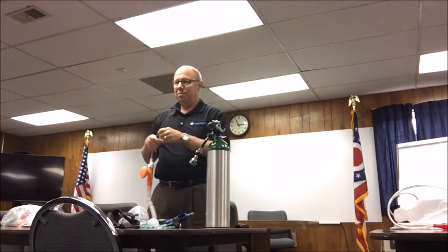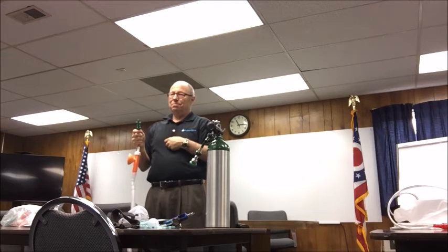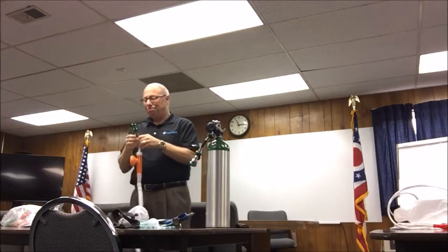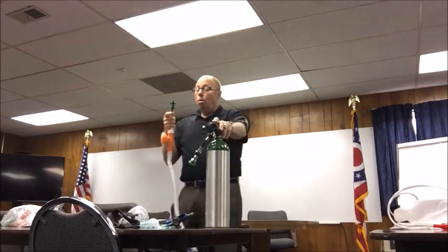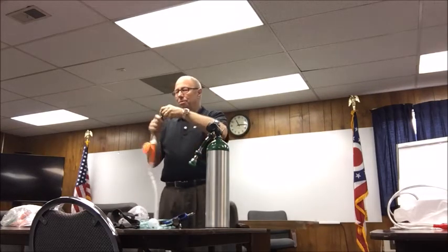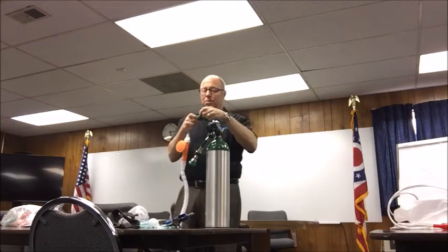I think they sent me one, and I used it, and then I got the wall, so I finally just, I don't know if it's right, but it worked. Yeah. All you do is twist it. And we can practice that here in a minute. So, if you don't have a pigtail on the tank, the redundant system is to take this off and screw it into the high pressure port.